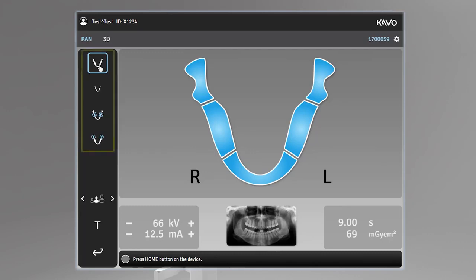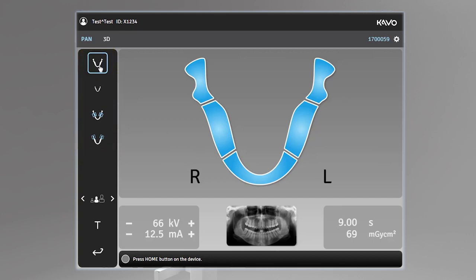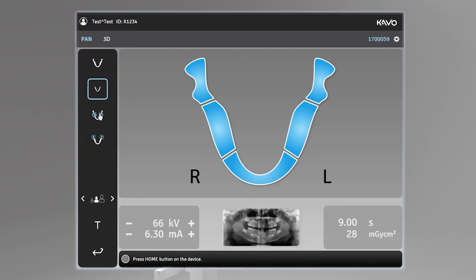There are four imaging modalities that can be selected from the screen: standard panoramic, pediatric panoramic, bitewing, and TMJ.